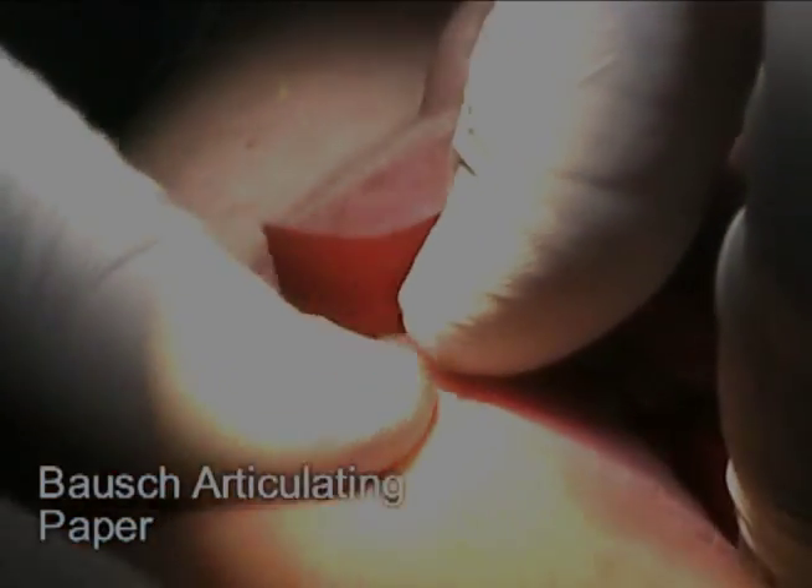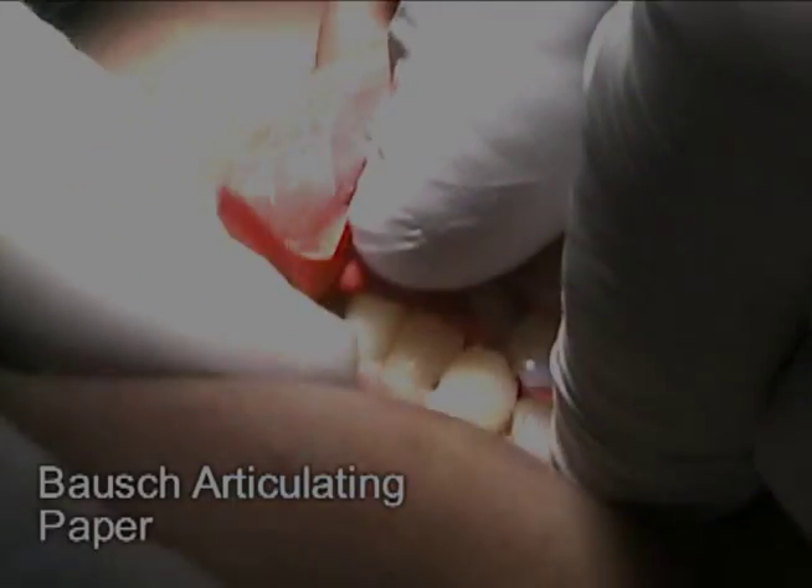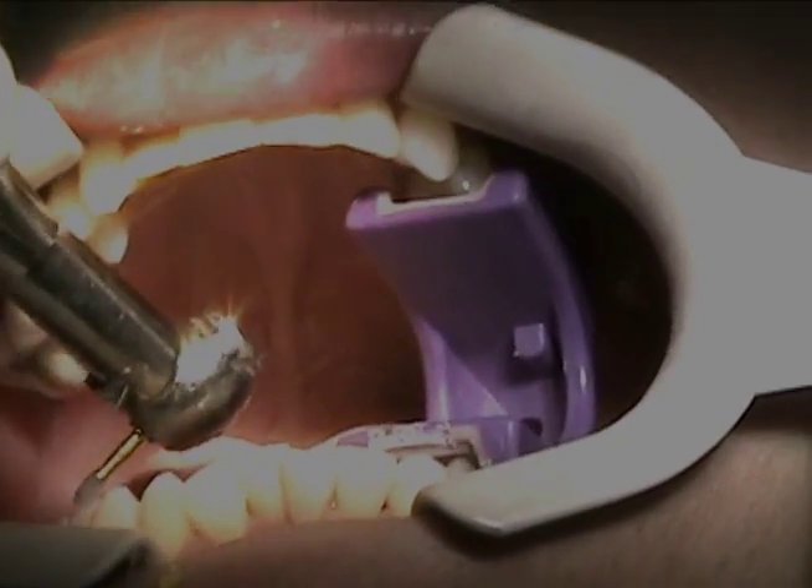Now bite together and tap together, and just tap up and down. Good. I need the blue horseshoe paper — open now, good, thank you. So we're just doing a little pre-op with the equilibration.